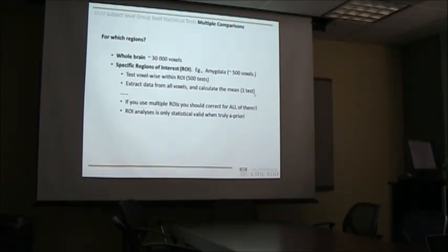And then, again, in this case, you're only left with one test, which is, you have to reduce this whole problem, which you start out to do whole brain analysis, tremendously. The downside is, suppose one part of the amygdala responds a little bit differently than another part of the amygdala, and you take the mean. You might average out any effect. So it's difficult to say what is the best. It really depends on the situation. I guess usually people just do all and see what comes out. That's the way it is.